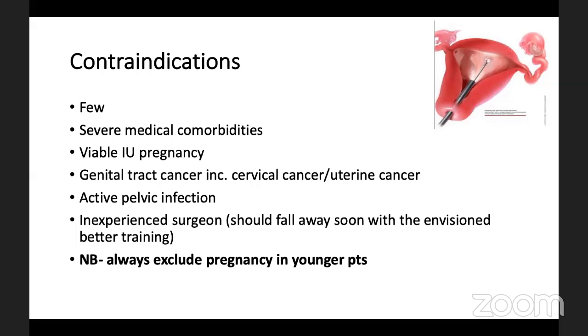I'm going to go through some of these later on, where we're now preparing our patient for the hysteroscopy to see whether we should go ahead or not. So obviously, if the patient has got an ongoing infection, they've got purulent, foul-smelling PV discharge, then hysteroscopy is not the best thing to do at that point. Then you can wait until they are recovered, and then you can go ahead with hysteroscopy. And then, of course, the contraindication, if you've not done hysteroscopy before, then you cannot offer it. And I'm hoping that this should fall away soon with the envisioned better training in our setting.